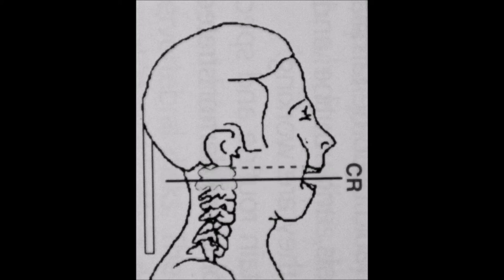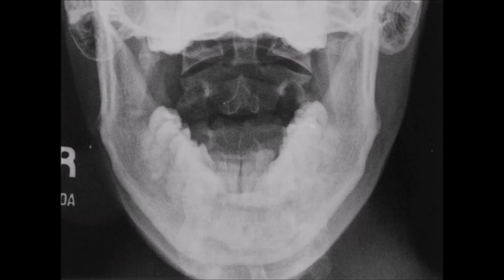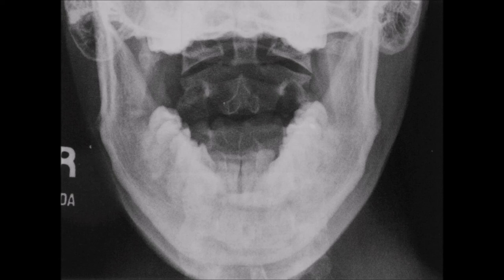The CR should also be perpendicular to the IR and directed at the center of the mouth when it is wide open. Collimate tightly to the outer four sides of the mouth using an 8x10 cassette with a grid. Suspend respiration and expose.